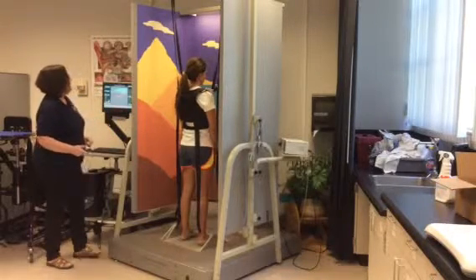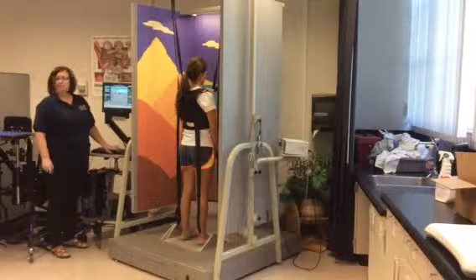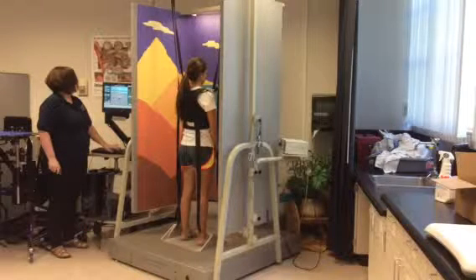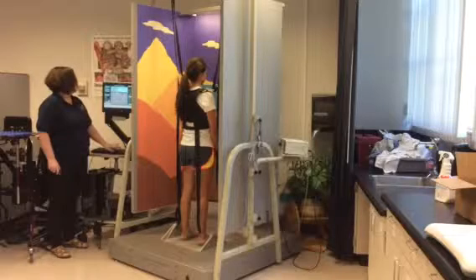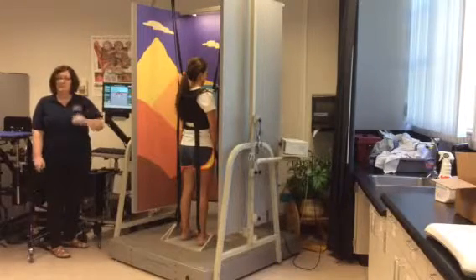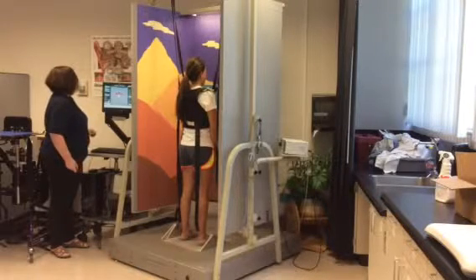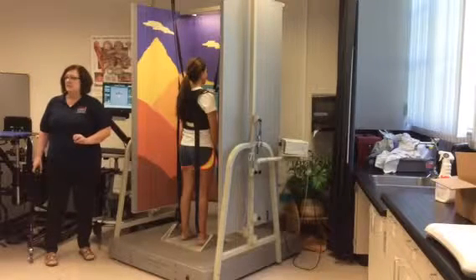Now, we already know that Erica doesn't like forward, right? So let's pick a target configuration that challenges her in the forward direction. How about that? Center 3 anterior targets. And it is currently set at 50% of her limits of stability.